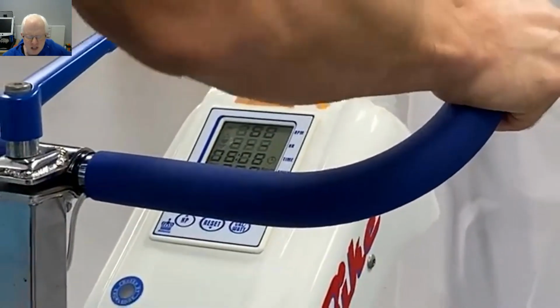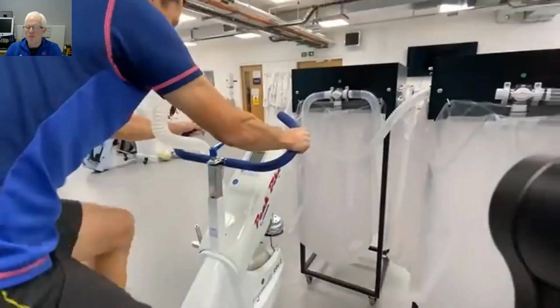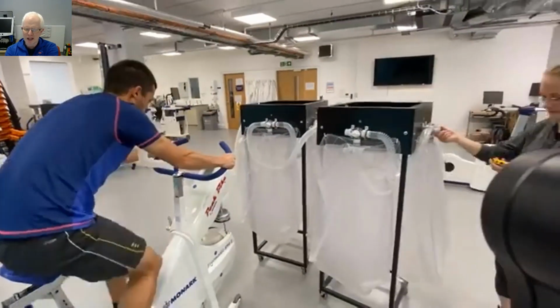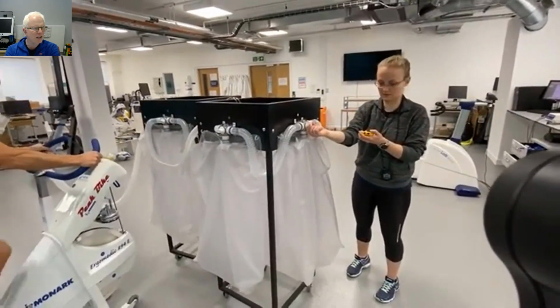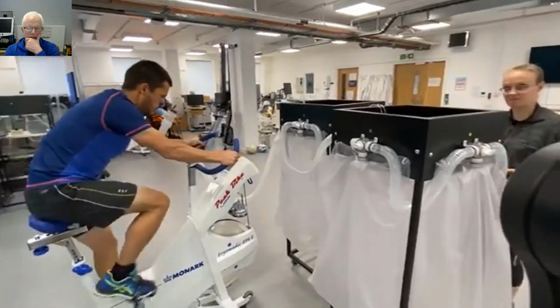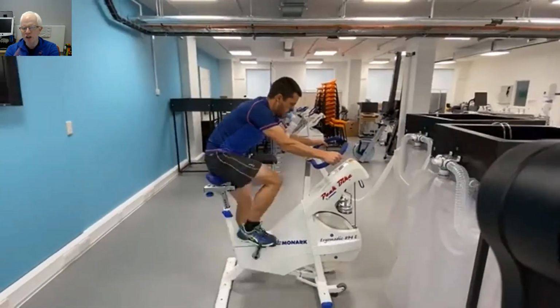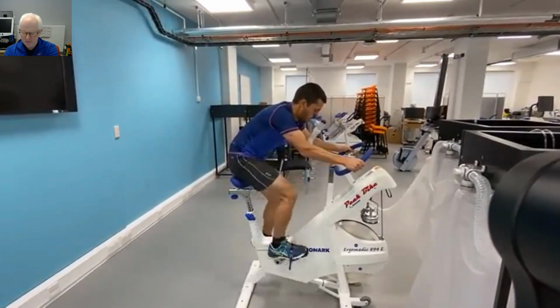Notice his cadence is holding nice and steady, mid-80s. He's just maintaining that cadence throughout. We're doing 30-second collections into these Douglas bags. We move from that bag into the next bag. He's already done a minute. So we've done a minute collection.